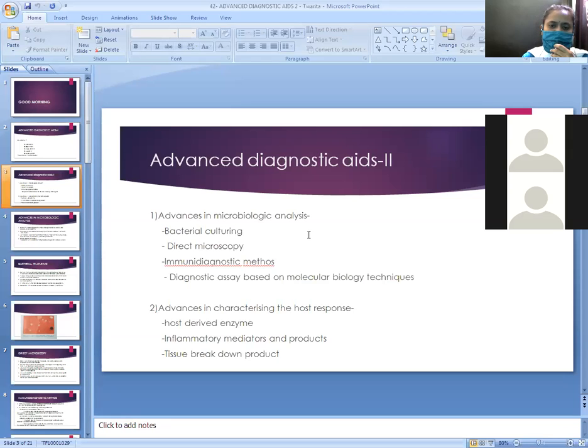Digital subtraction radiography, or subtraction radiography. Subtraction means minus. We know that this is a mathematical term. So subtraction radiography means what? Subtracting the unchanged part from radiographs, meaning the unchanged anatomical structures which are there.